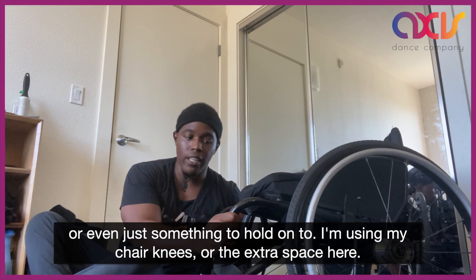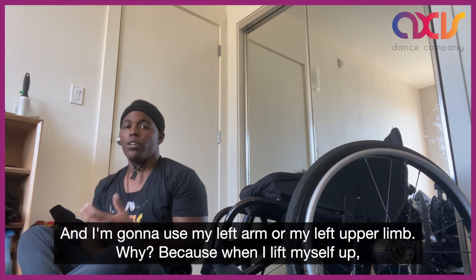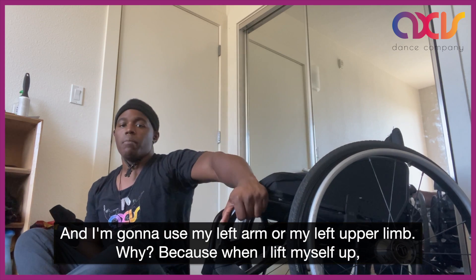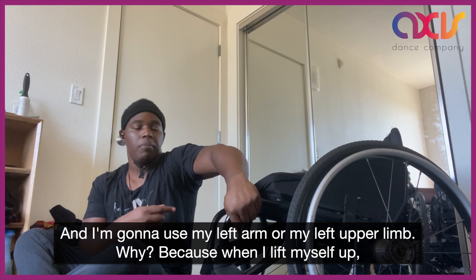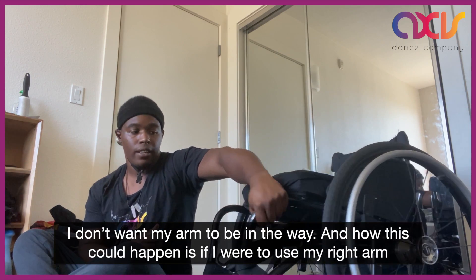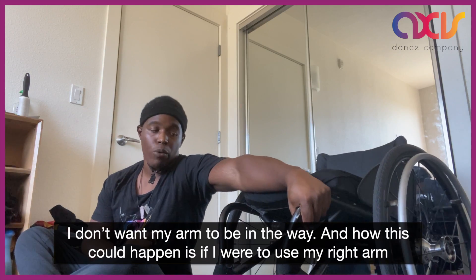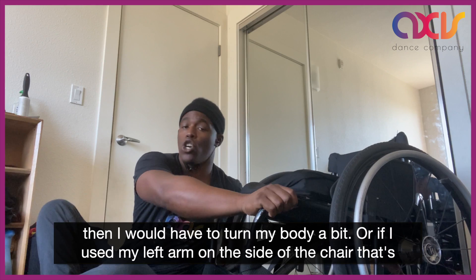I'm using my chair's knees or the extra space here and I'm going to use my left arm or my left upper limb. Why? Because when I lift myself up I don't want my arm to be in the way, and how this could happen is if I were to use my right arm then I would have to turn my body a bit.